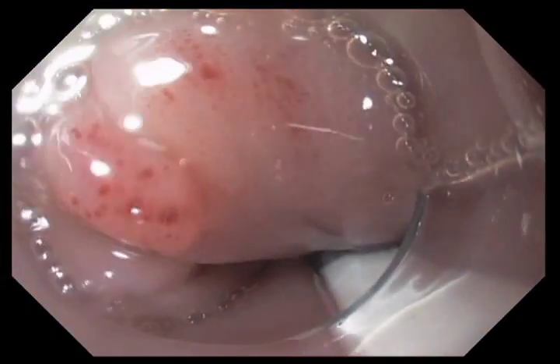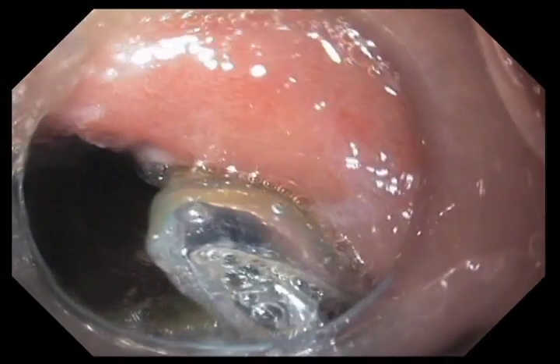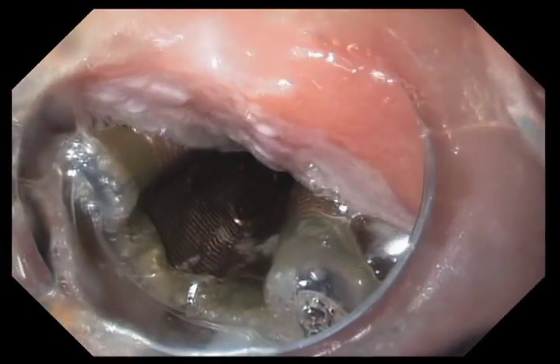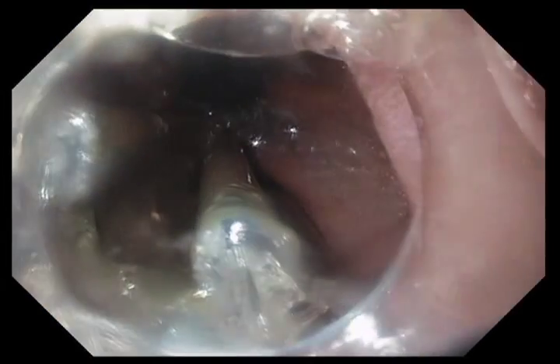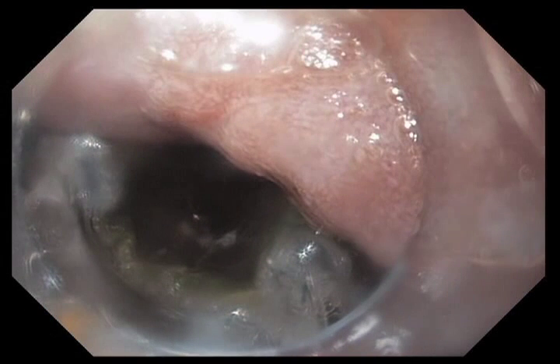We send the patient home with some pain medication and a solution of Maalox and lidocaine to take before they eat. We have them continue on double doses of PPI, and then we see them back in three months. You can see the treated area we just went past — it's got sort of a whitish tinge to it, that's the retreatment. We'll bring this patient back in three months and touch up any areas we didn't fully treat on the first treatment.